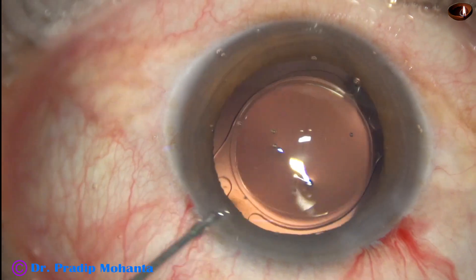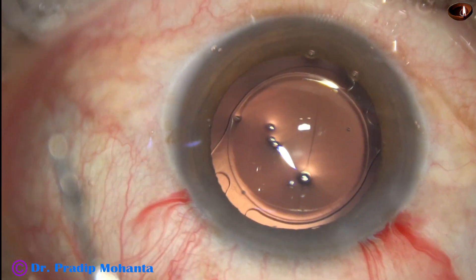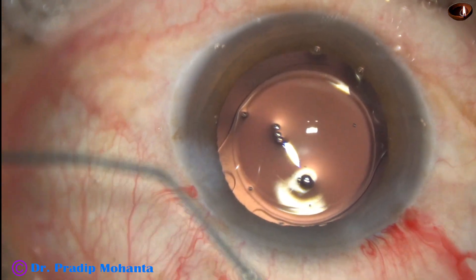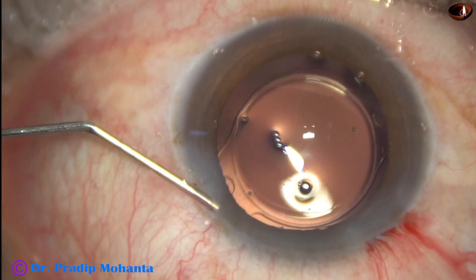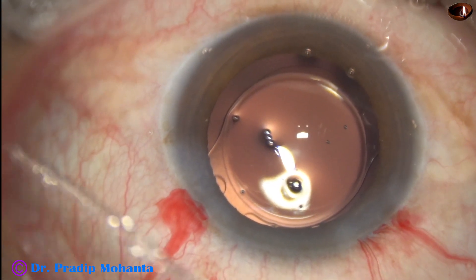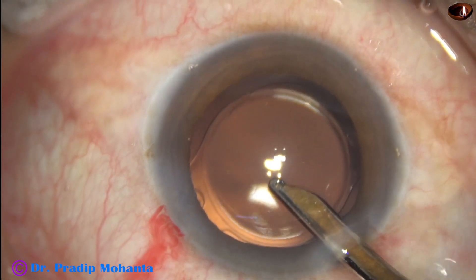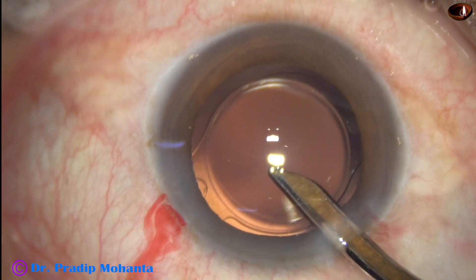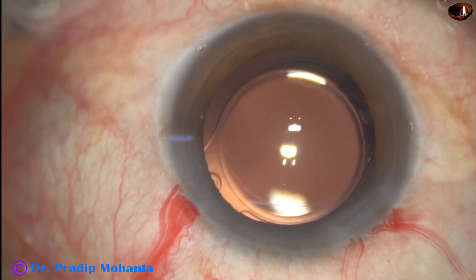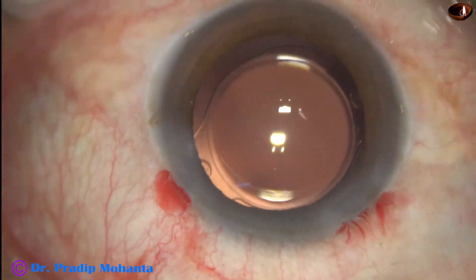Now moxifloxacin is injected into the anterior chamber and then the side port is closed by hydrating the corneal stroma. We are towards the end of the surgery. The anterior chamber is thoroughly lavaged — this final lavage reduces the risk of TASS. The integrity of all the wounds is checked and the case is concluded.